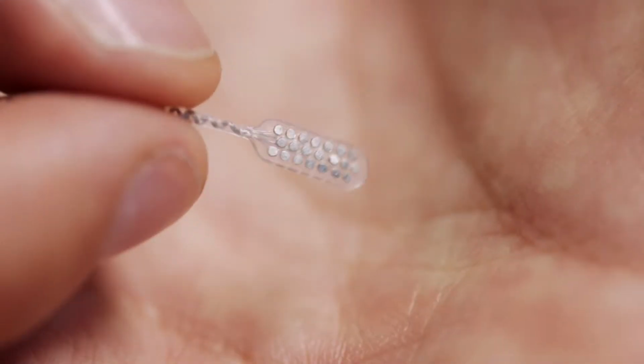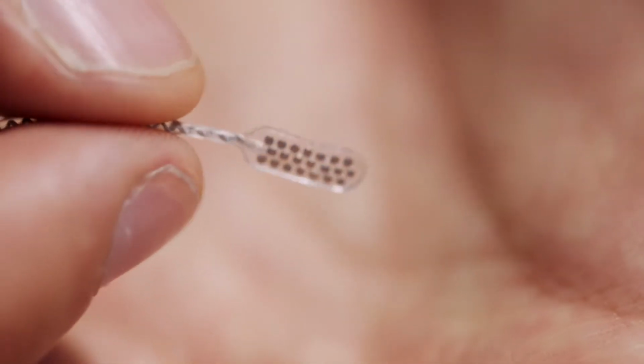A challenge with current clinical ABIs is their relative stiffness, so that the electrodes do not selectively stimulate the auditory brainstem. We teamed up with a group of Professor Danley at Mass Eye and Ear in Boston to design a novel technology to manufacture soft auditory brainstem implants. One of the challenges was that we wanted to use the same materials that are used in the clinic, but these materials are rigid. So we introduced a way to engineer elasticity in these same materials.